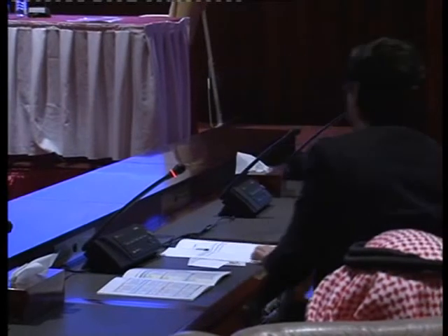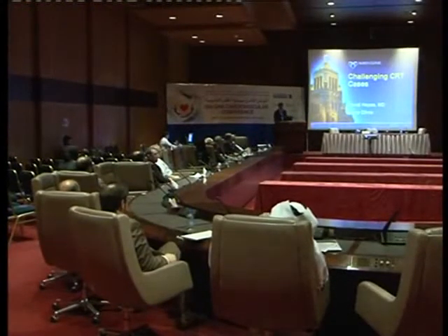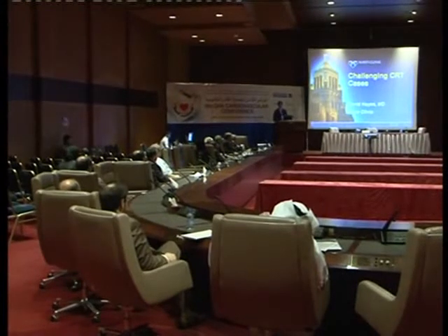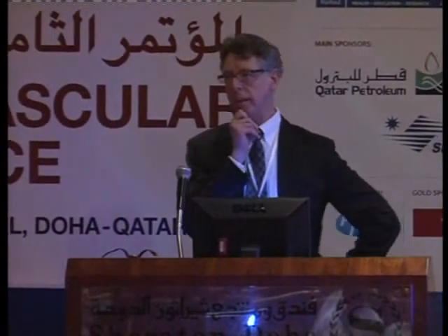Dr. Hayes: Thanks very much. So in the next few minutes on the challenging CRT cases, I've got 3 cases, 2 of which are post-CRT, 1 is pre-CRT. And the first one, which I used in the last session, I'm going to use it here because for my own edification, I'd like some input into what others would do.